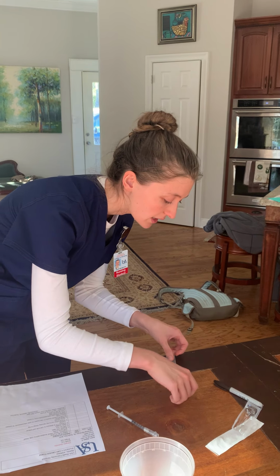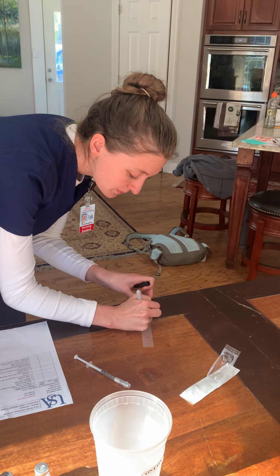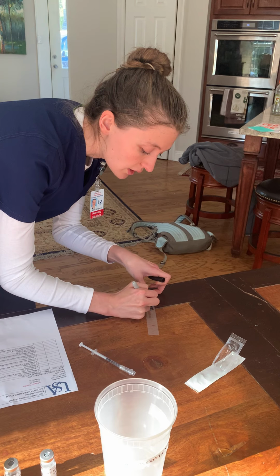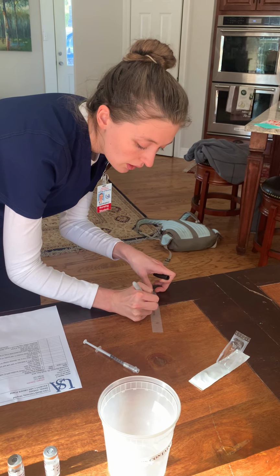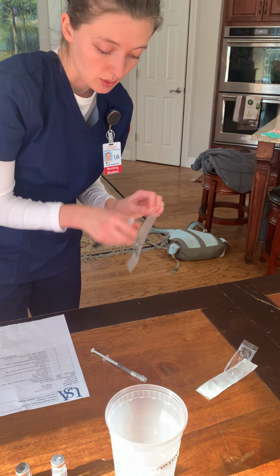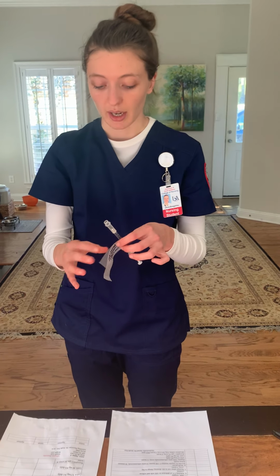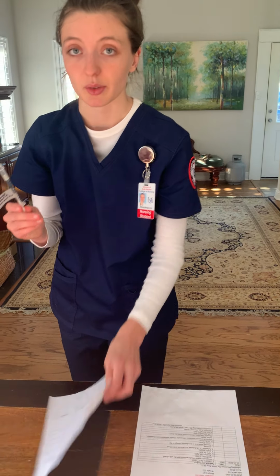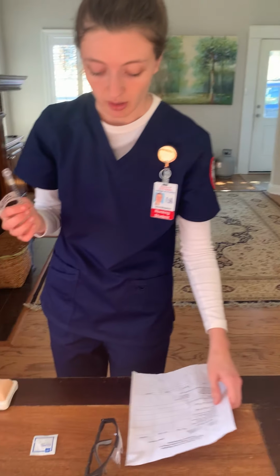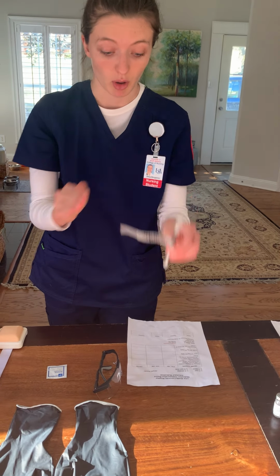I'm going to now write the patient name, which is Jaguar Jones. I'm going to write the medication, and I'm going to write the dosage. And I'm going to put that on to my syringe, and I will now be going into the patient's room with my medication administration record and my syringe. I enter the room. I'm going to place this down with the safety cap on.